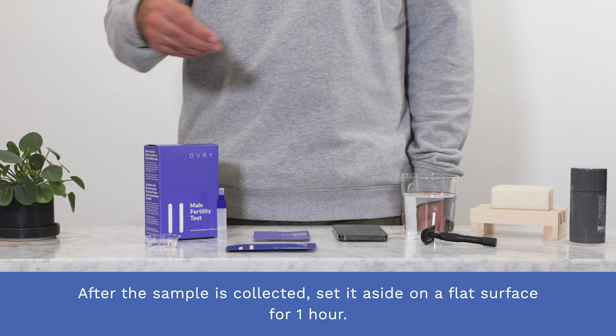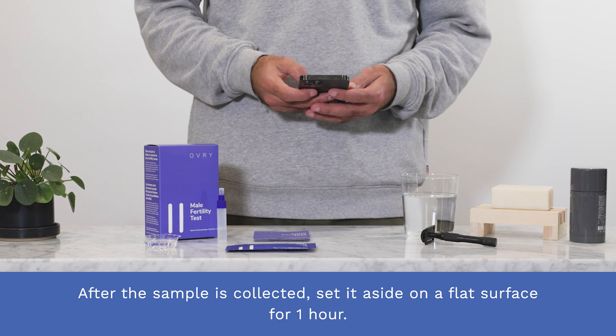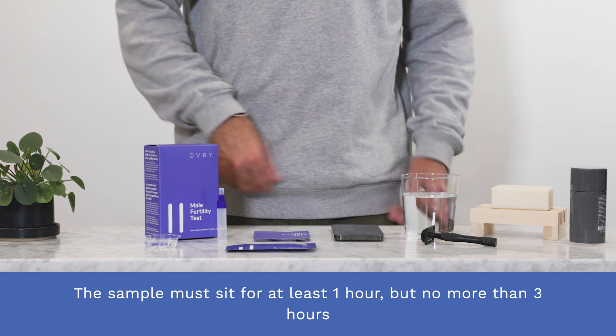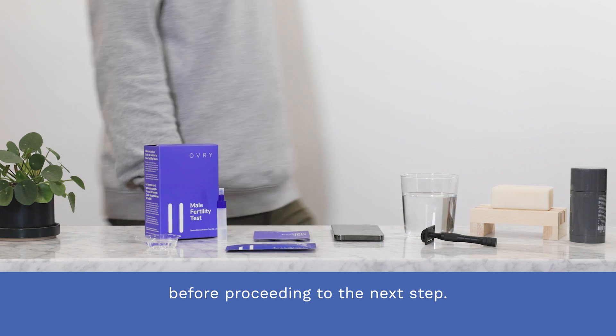Step two. After the sample is collected, set it aside on a flat surface for one hour. The sample must sit for at least one hour, but no more than three hours, before proceeding to the next step.